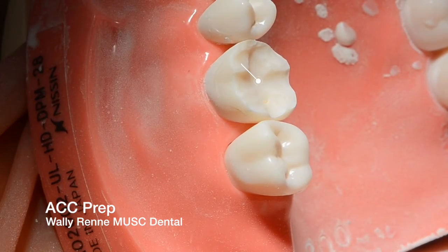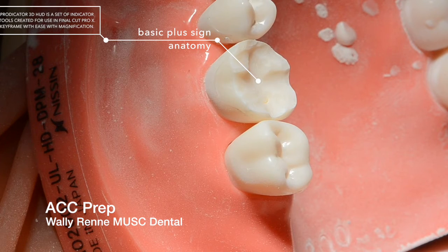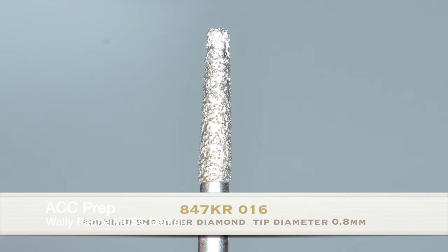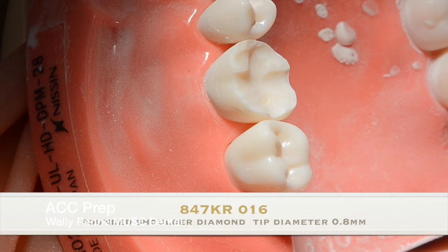Very simple with all ceramics — you're not really concerned about keeping every little detail of the anatomy. It's semi-anatomical reduction and it's not fully anatomical like with a PFM. Now you're going to switch to the shoulder diamond.